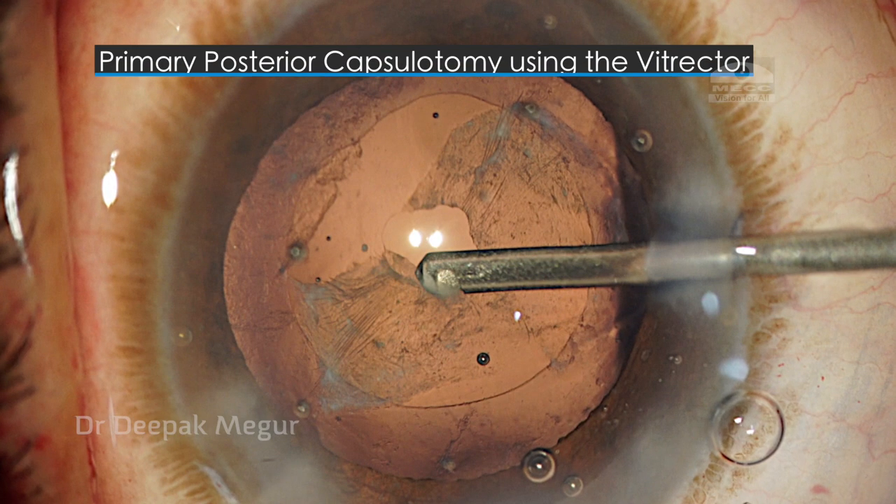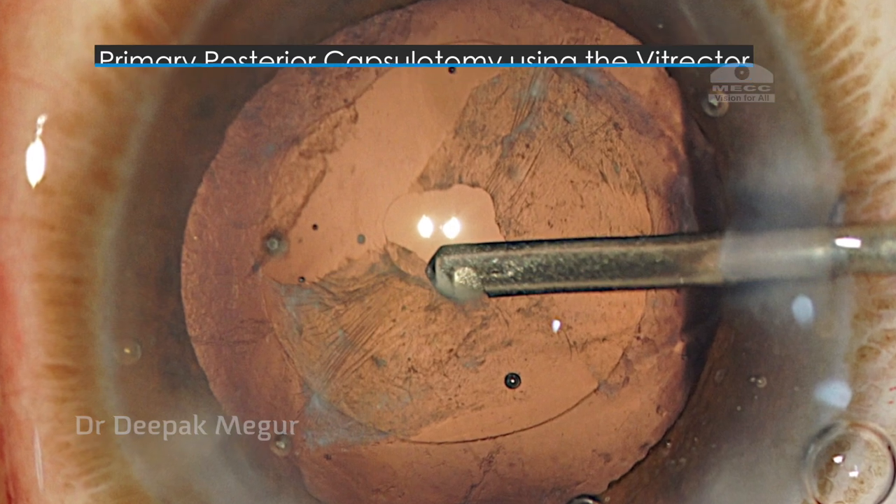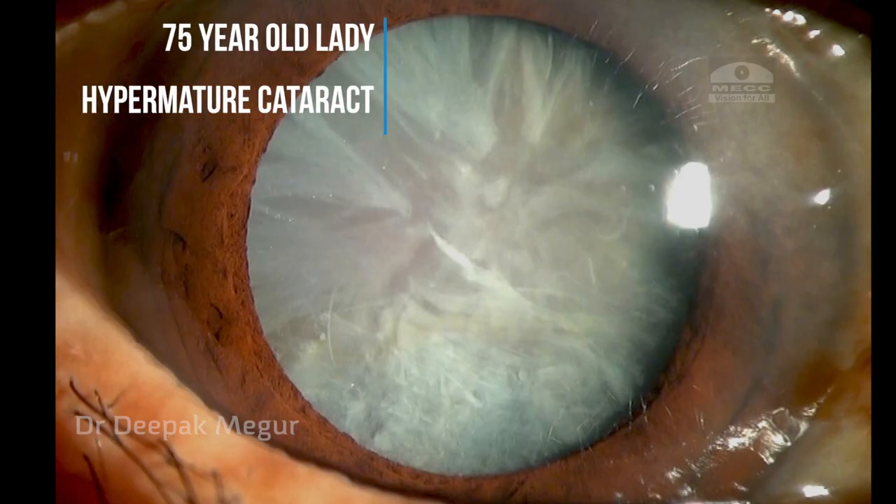Hello friends, this is Dr. Deepak Megur and today I'll be sharing a few practical tips regarding performing posterior capsulotomy with a vitrector.